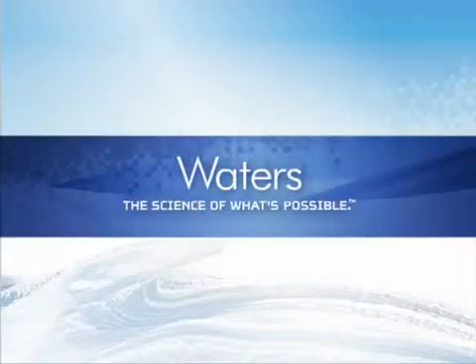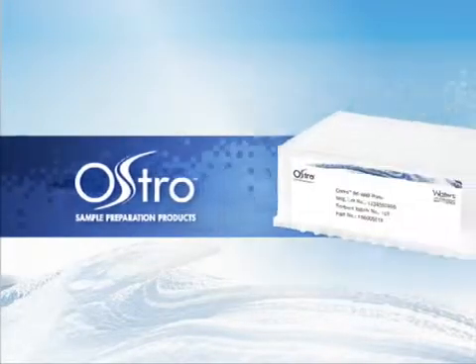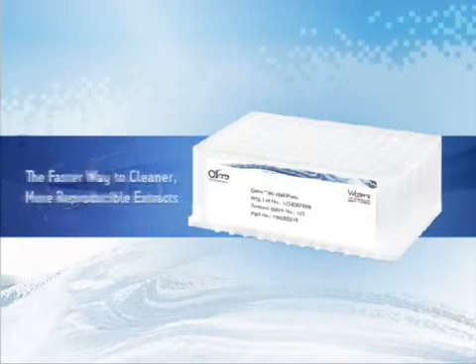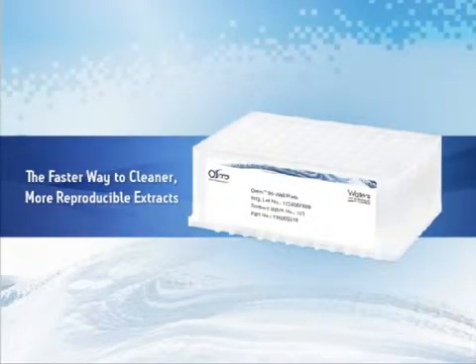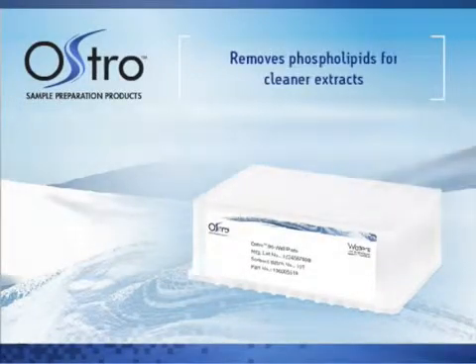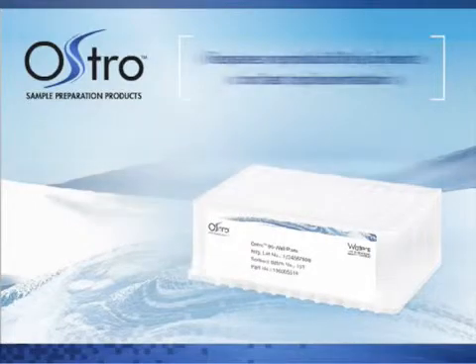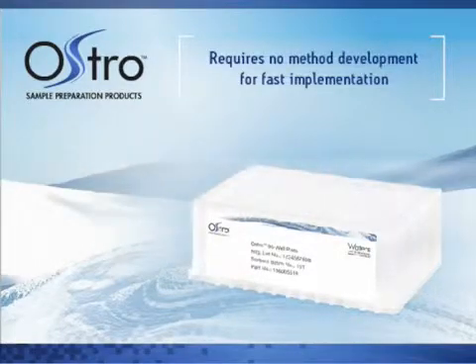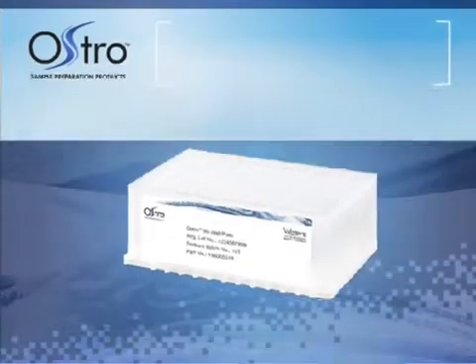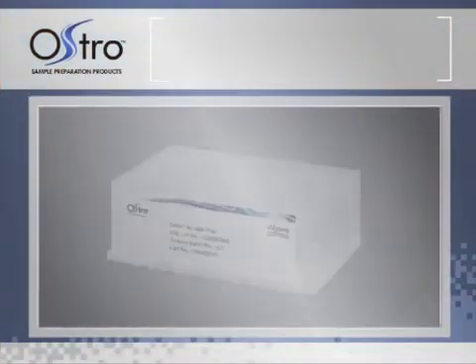Waters Corporation is pleased to introduce the Ostro Sample Preparation Plate. Using a simple generic protocol requiring minimal or no method development, Ostro effectively removes phospholipids in plasma and serum prior to LC-MS-MS analysis. In this brief video, we will demonstrate how to achieve outstanding results with the Ostro Plate.